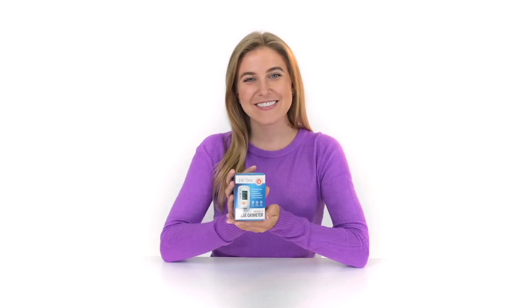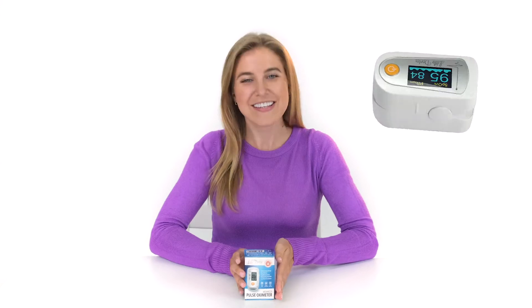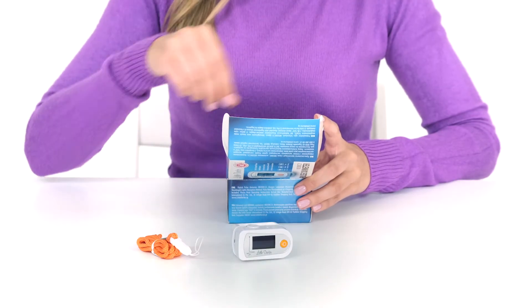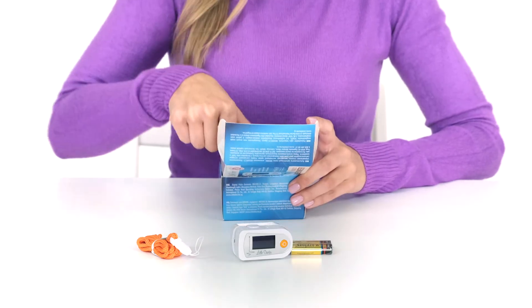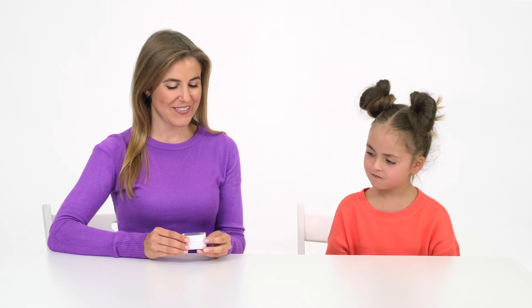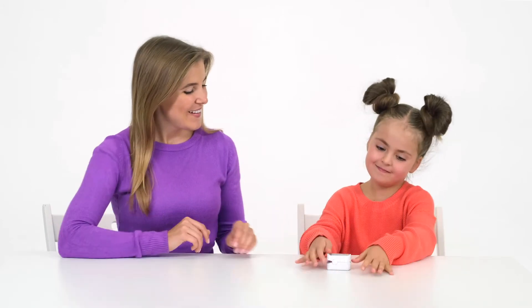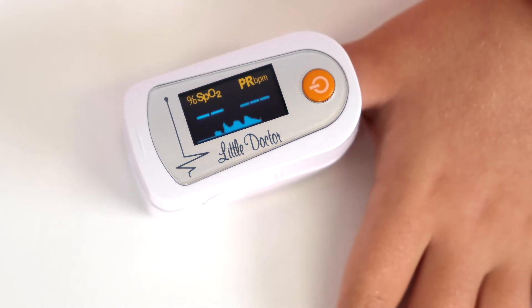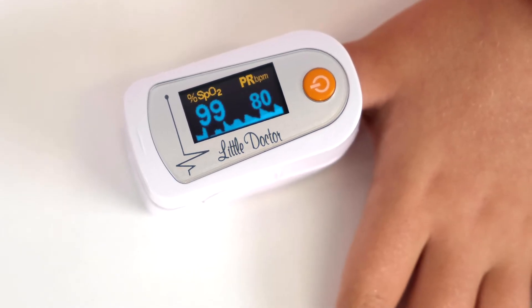Little Doctor Company would like to bring to your attention a modern medical device: the fingertip pulse oximeter, designed to measure the level of oxygen saturation and pulse rate. The device uses a pulse oximetry method that allows you to quickly, accurately, and continuously monitor the important characteristics that state the condition of the human body.